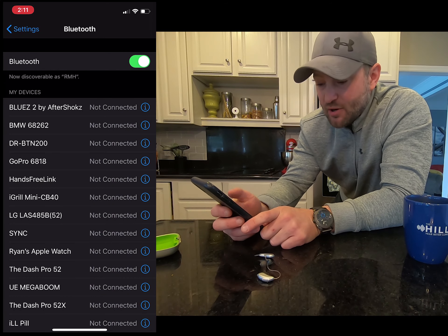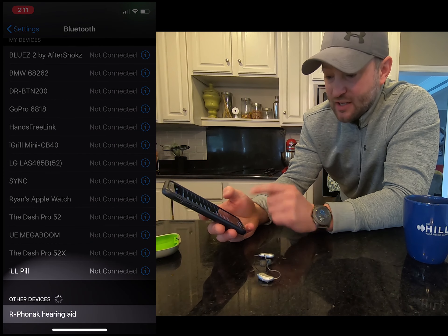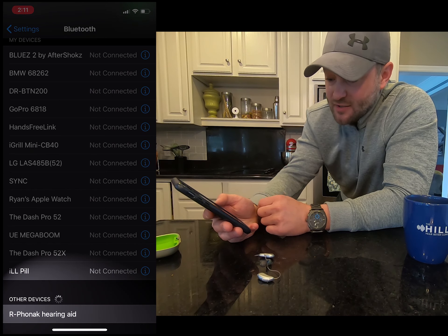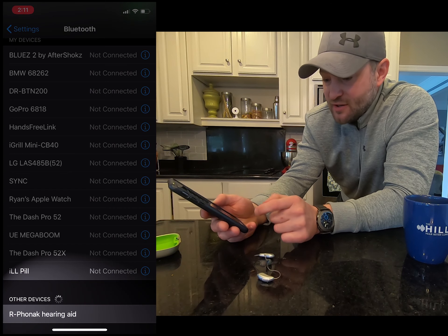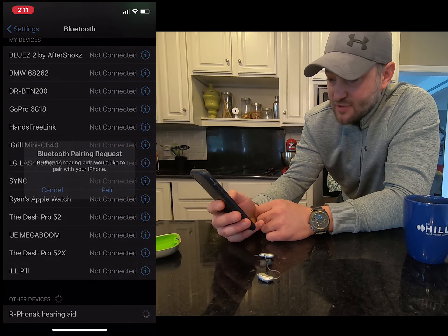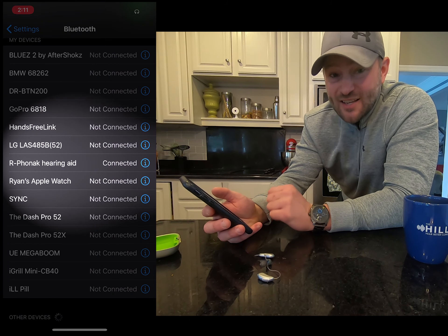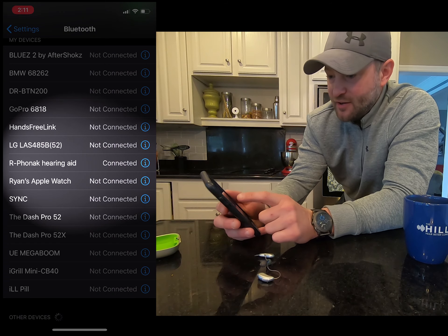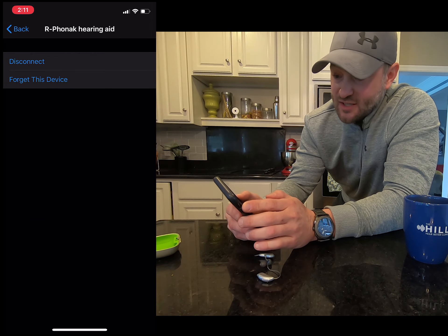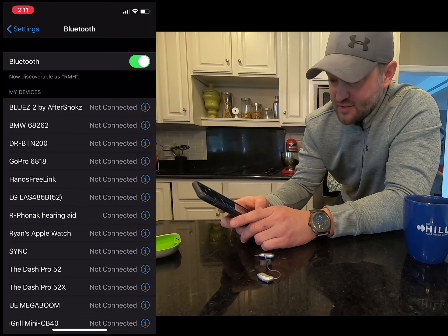I'm going to click on Bluetooth and now close both of the battery doors fully. With the Phonak hearing aids all we really have to do is pair one hearing aid — we're going to wait until under 'Other Devices' it reads the right hearing aid, because usually it defaults to the right one unless your audiologist or hearing aid dispenser has specified otherwise. Now it's going to ask me to pair the right one, and we're not worried about the left in this case.